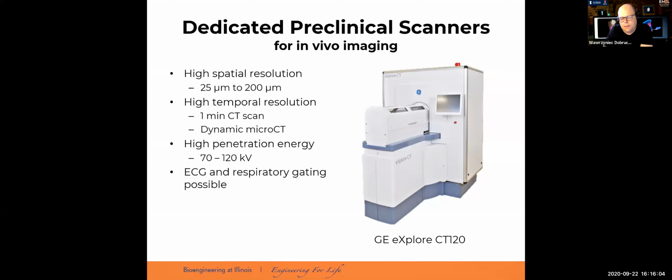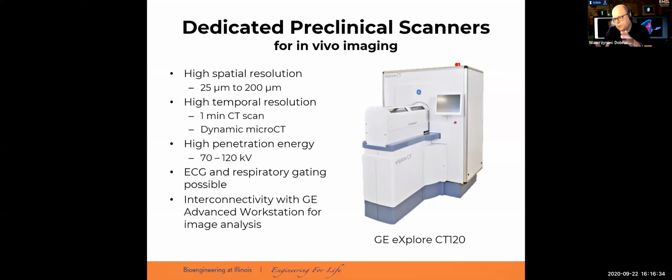We'll be talking about the ECG and respiratory gating during our discussion on quantitative imaging later in the semester, so I will not cover this right now. And then, of course, because it was produced by GE Healthcare, it allowed interconnectivity with a clinical, full-featured GE Advanced Workstation for image analysis. So we could take, for example, the images acquired in this preclinical scanner to the hospital to do all types of processing using the clinical image analysis workstations.